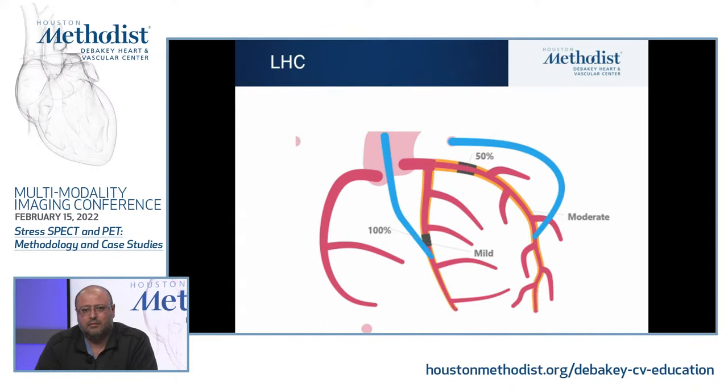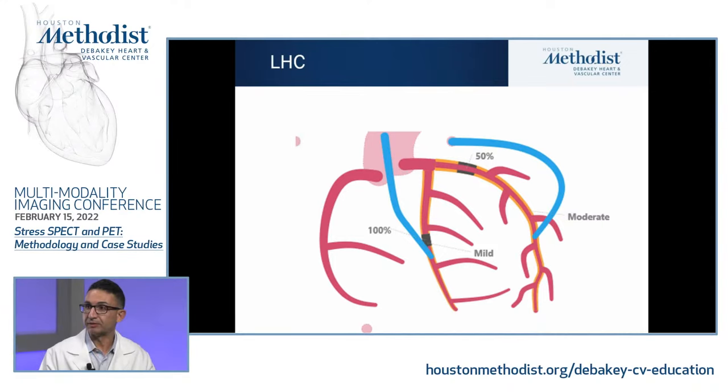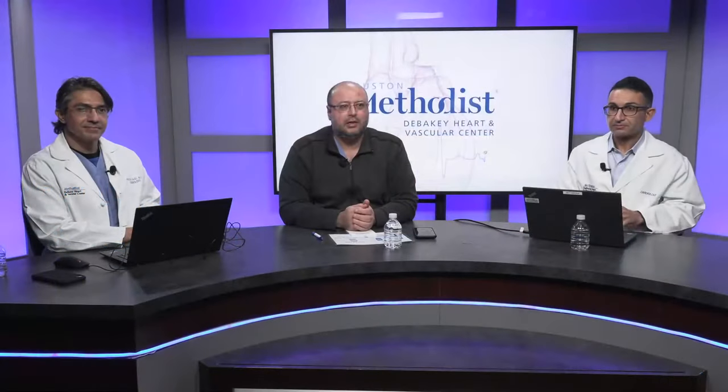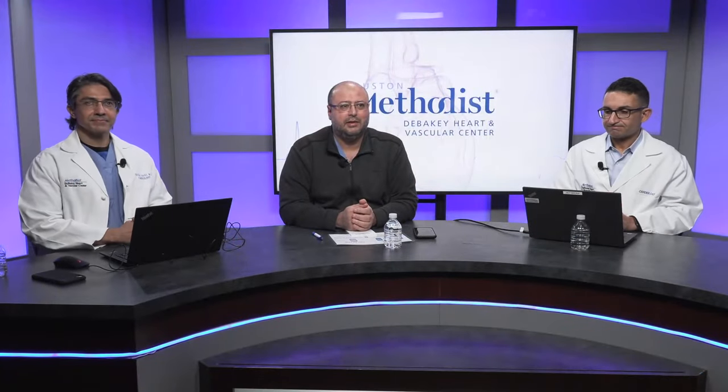This patient also had a coronary angiogram, done as part of his workup, which showed normal and patent grafts to the LAD and circumflex. Interestingly, there was no comment on the RCA graft in this setting, which brings us to the point that PET is a great tool for assessment in these patients post revascularization, as Dr. Al-Mallah clearly mentioned.